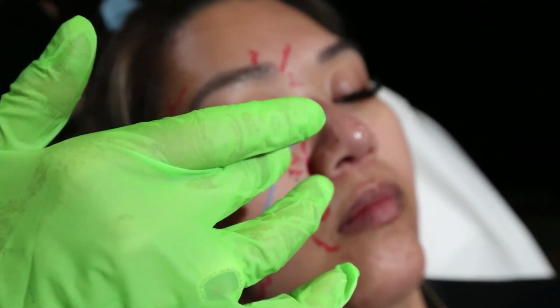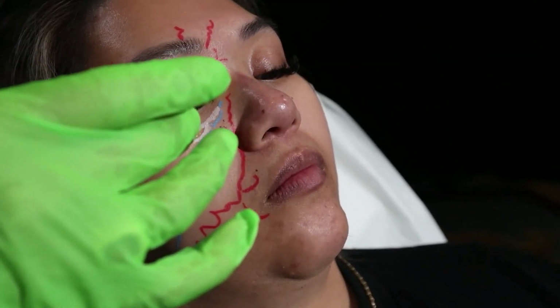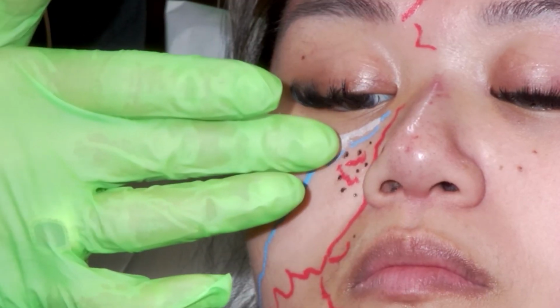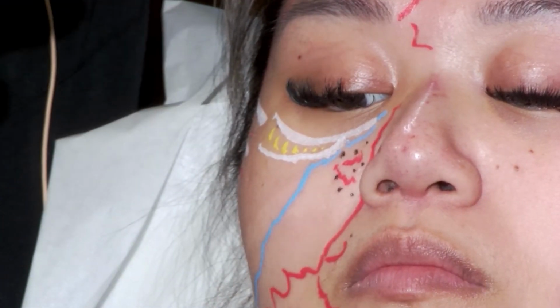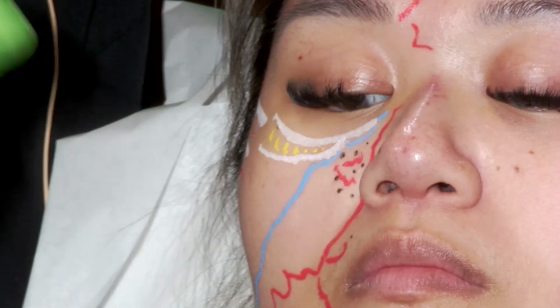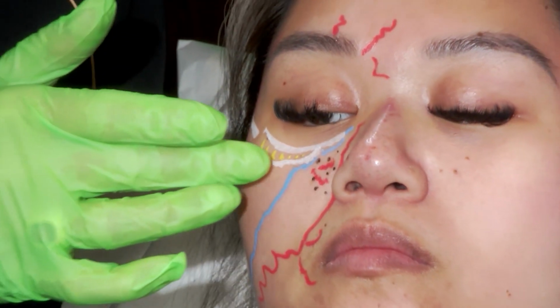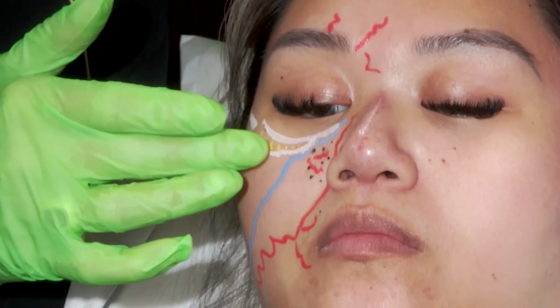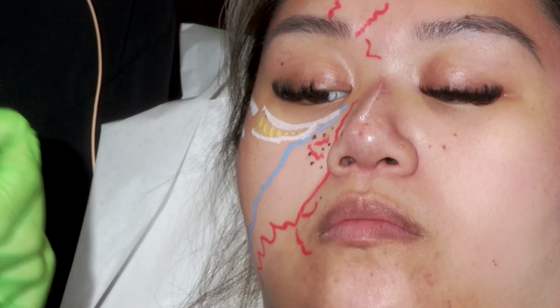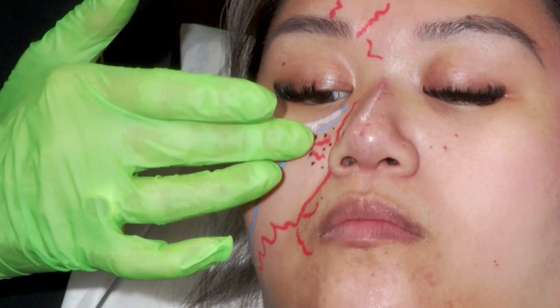Puncture, and then you want to be in the deep fat pad, in a deep space. If you are in the more superficial space, it will look fine while you're putting in the filler. It really will. But when the patient smiles, they will look a little alien-like because it will bulge. So it's a little spicy as you cross the infraorbital foramen. I will often give my patients a little 2% lidocaine block ahead of time. But you want to be deep in here.